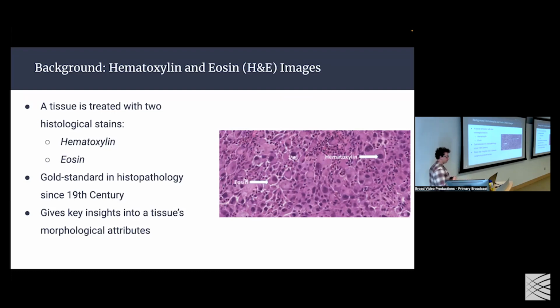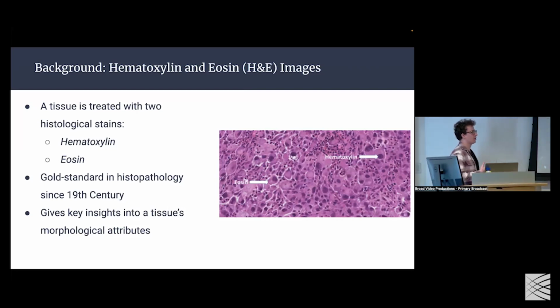It's an imaging method whose key takeaway is that you get to see up close what a tissue looks like, with keen details of single cell morphology, et cetera.